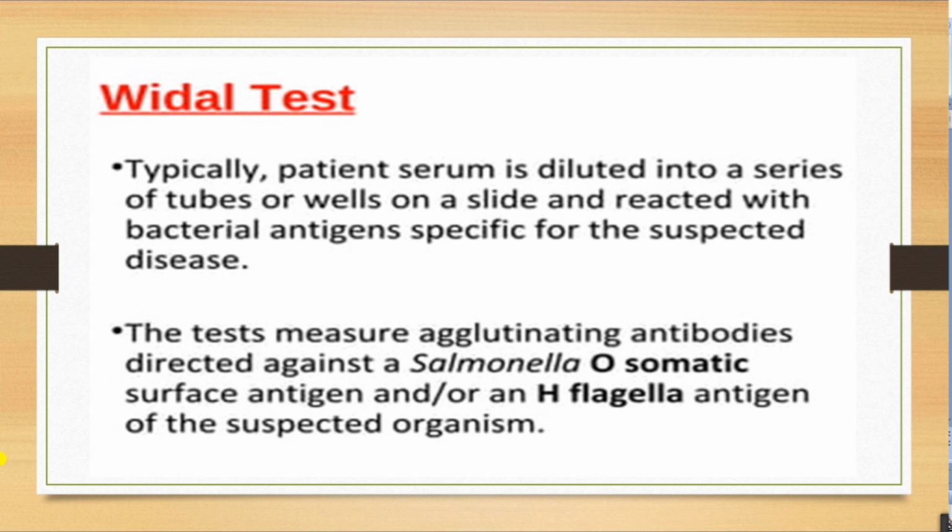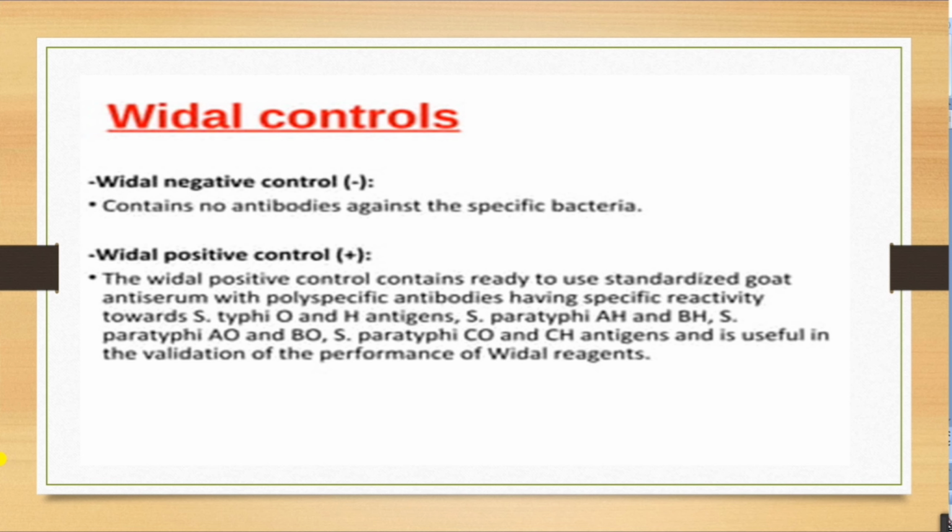The controls of the Widal test: the Widal negative control, which contains no antibodies against the specific bacteria, and the Widal positive control, which contains a standardized goat antiserum with polyspecific antibodies having specific reactivity towards S. typhi O and H antigens, S. paratyphi AH and BH, S. paratyphi AO and BO, S. paratyphi CO and CH antigens, which is useful in validating the performance of the Widal reagent.